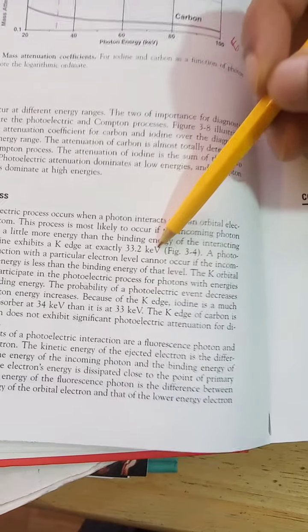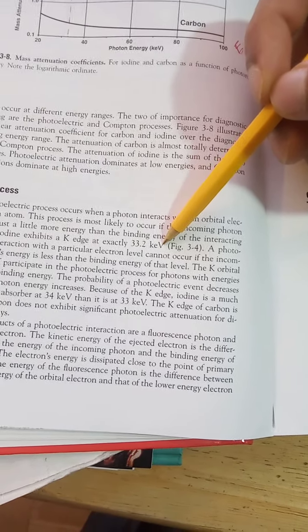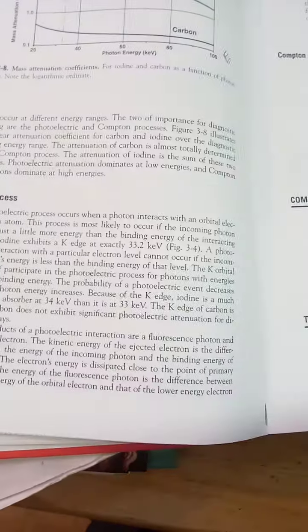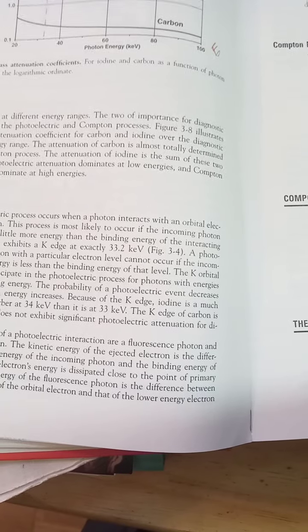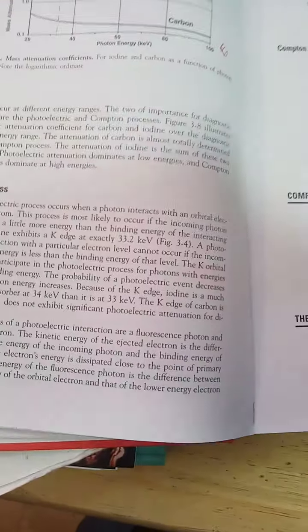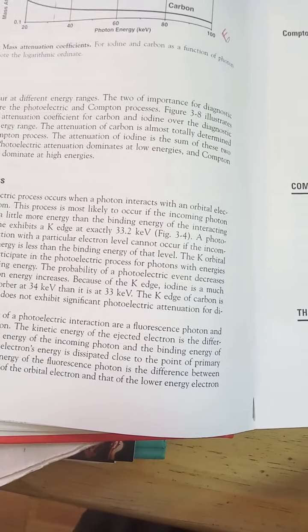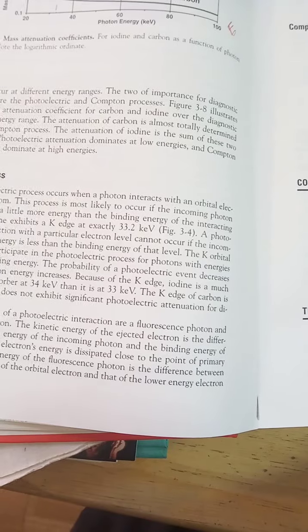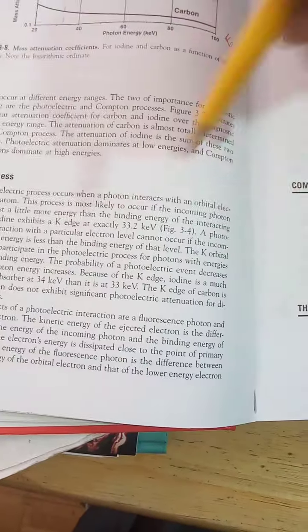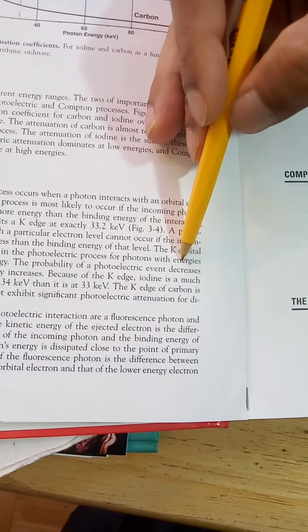So this is the value for the K edge of iodine, and a photoelectric interaction with a particular electron level cannot occur if the incoming photon's energy is less than the binding energy of that level, i.e. K, L, M, N or S, P, D, F, G. The probability of the PE event decreases rapidly as photon energy increases.